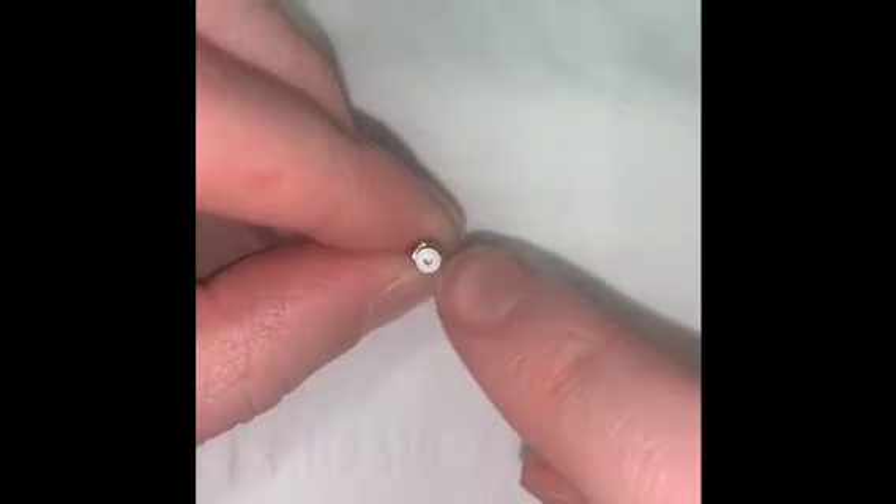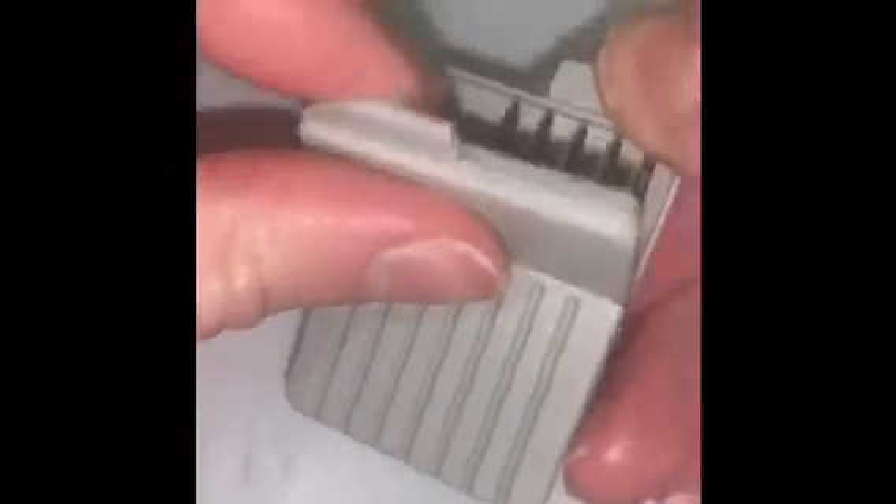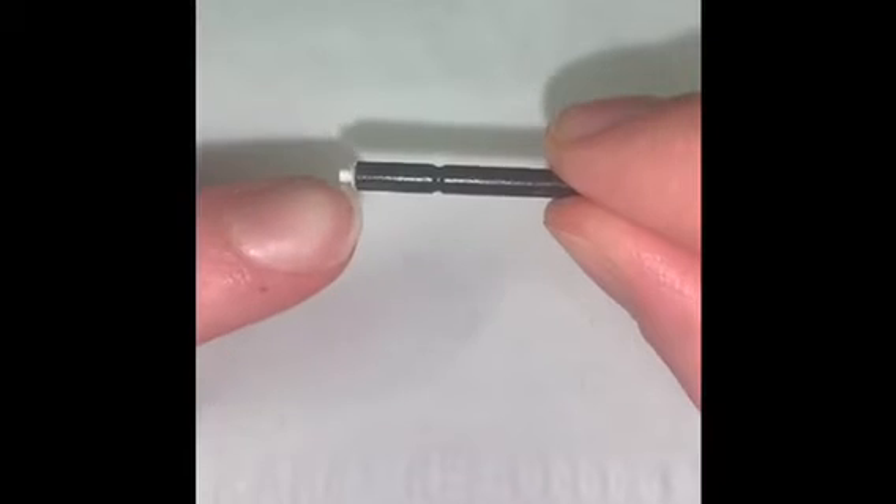Now we will be replacing this white circle here, so you're gonna grab your box of wax filter sticks and remove one stick. The stick will have an empty side here and a clean side over here.